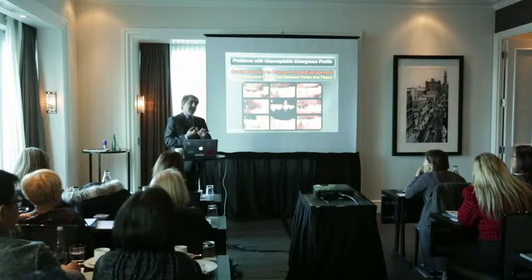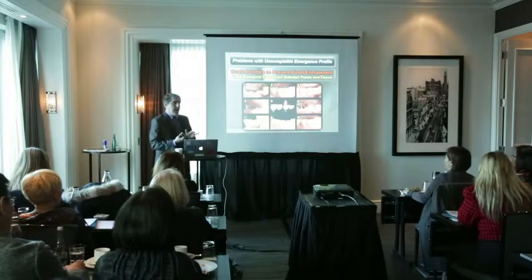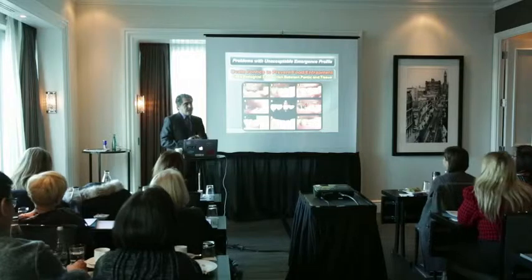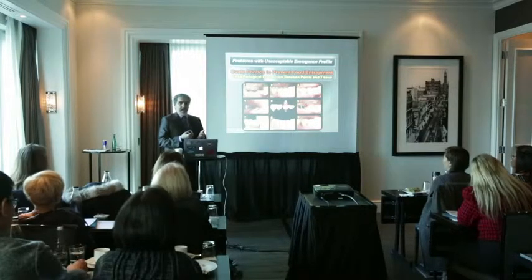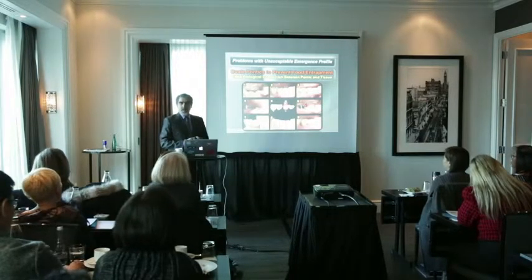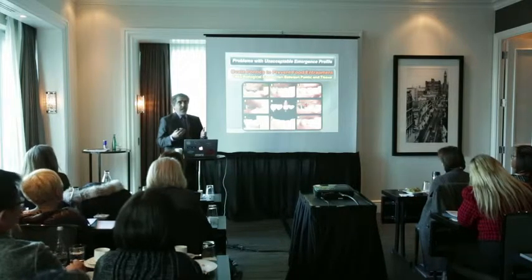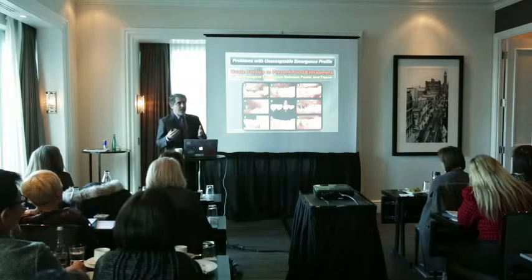Extremely important. In many cases, we need to make a sacrifice and restore implants with unacceptable positions in a way that we don't have the contact properly between them.